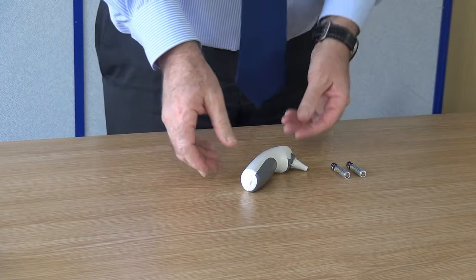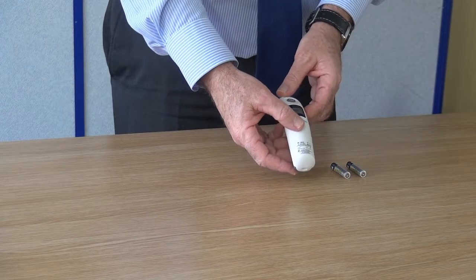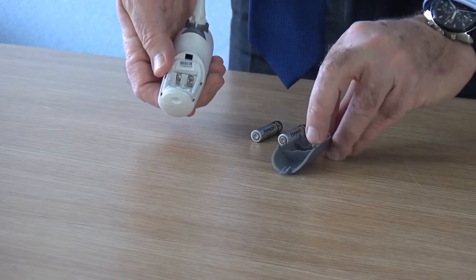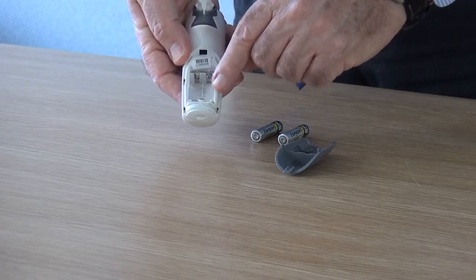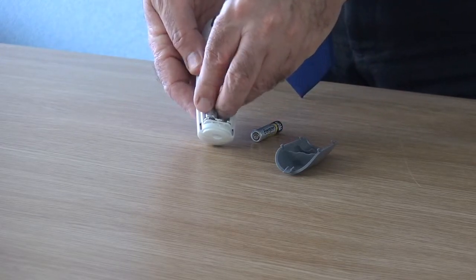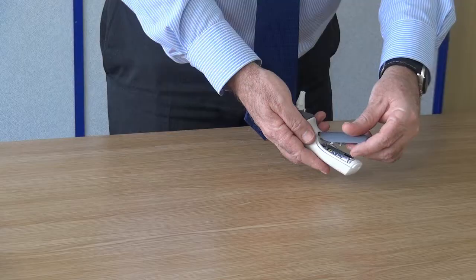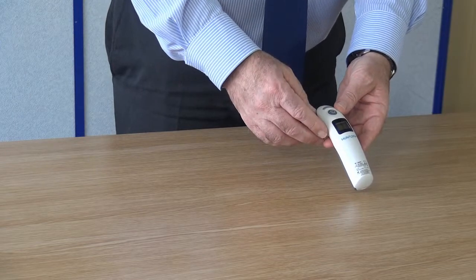The temperature sensor is powered by two AAA batteries. The battery compartment is on the underside. Remove the grey cover and fit the batteries into place, paying particular attention to the polarity. Refit the cover. The sensor is now ready to be paired to the main unit.